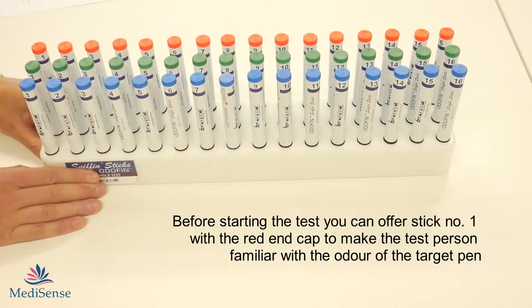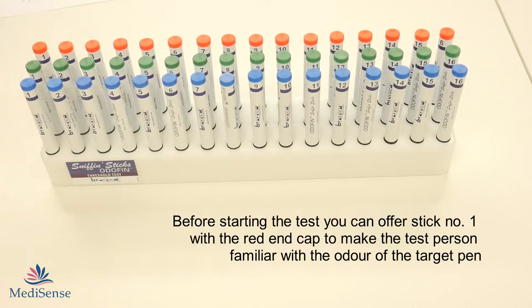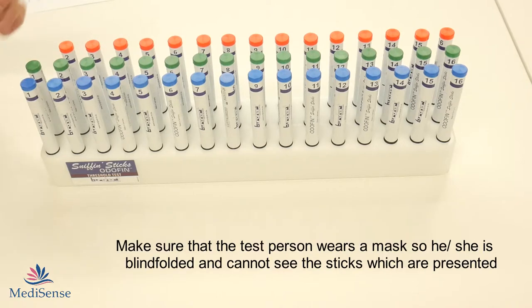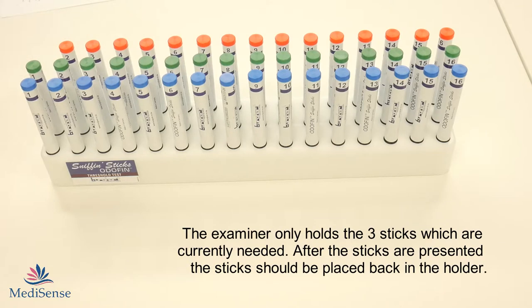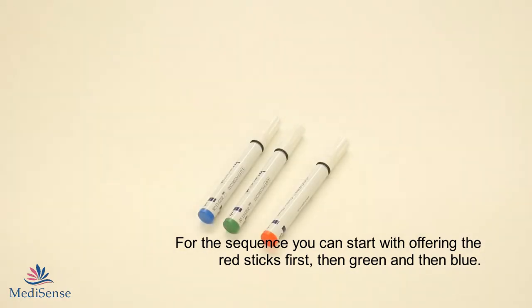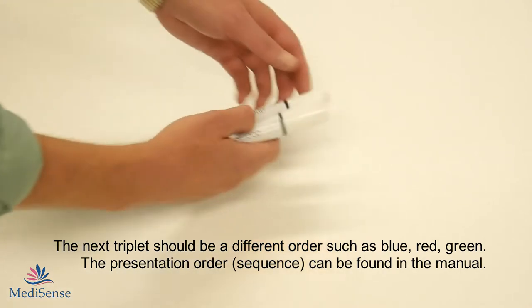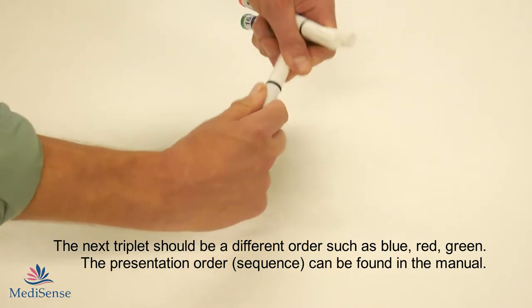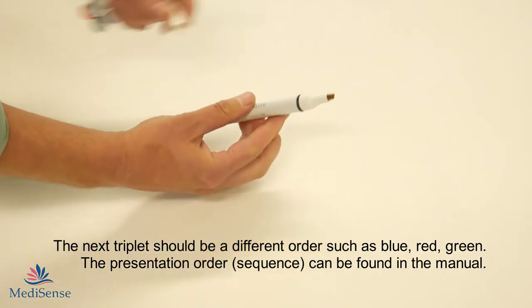When starting the test, it can be useful to offer the red number 1 to the test person so he can get familiar with the concentration and which odor he has to detect. With the threshold test each time you offer 3 triplets with the red pen being the target. The other 2 don't have odor.